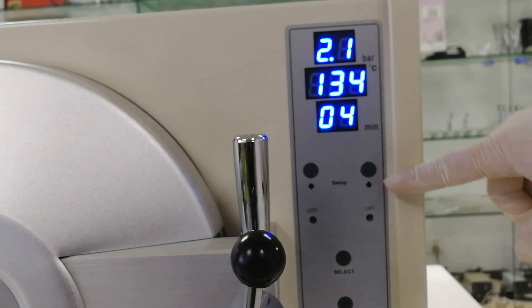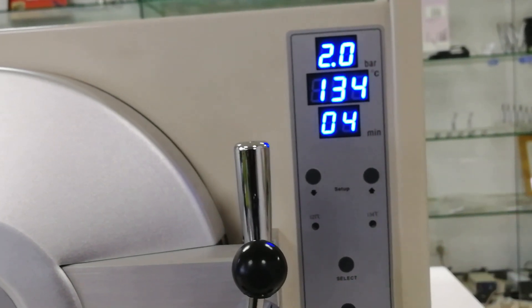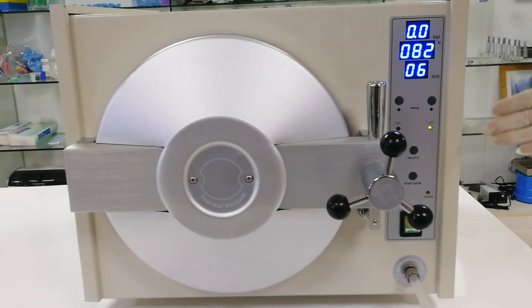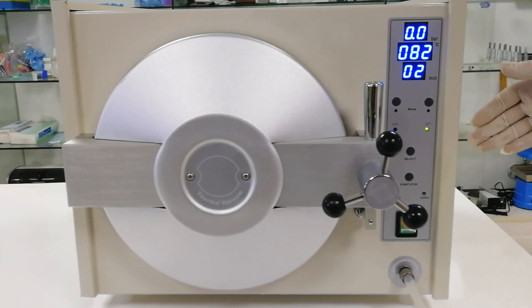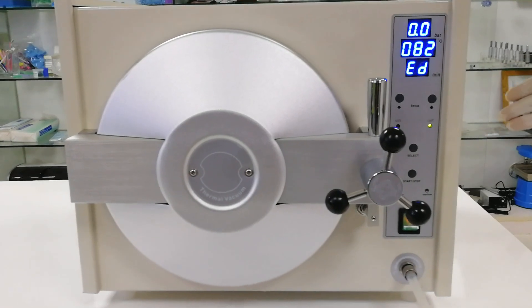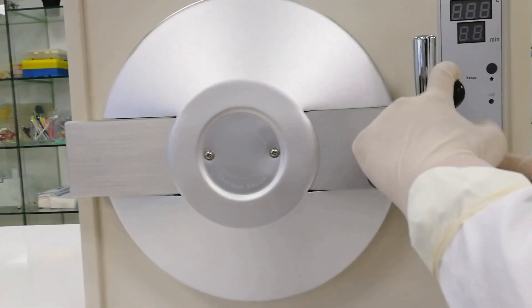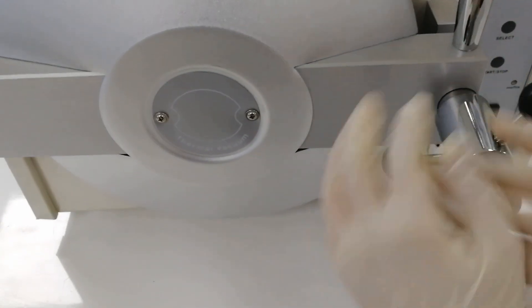We're waiting for the second process of the sterilization cycle. Now it's at the end of sterilization and there will be a sound signal to indicate the sterilization time is complete. We close the barrier and open the autoclave to see the result.